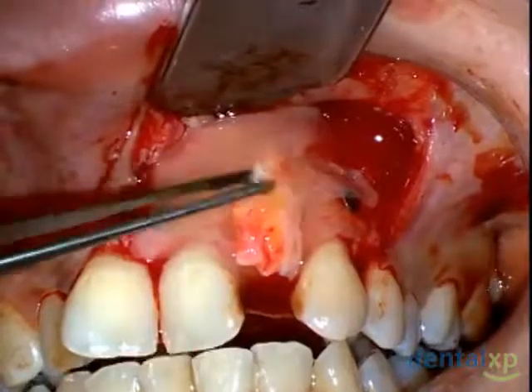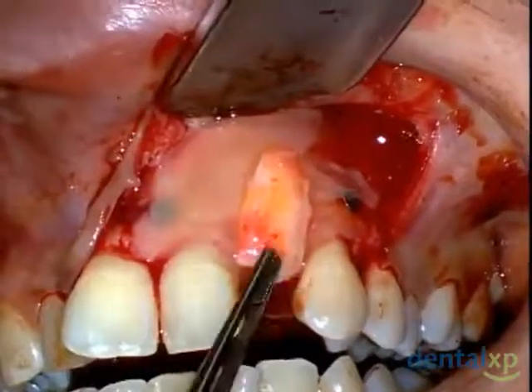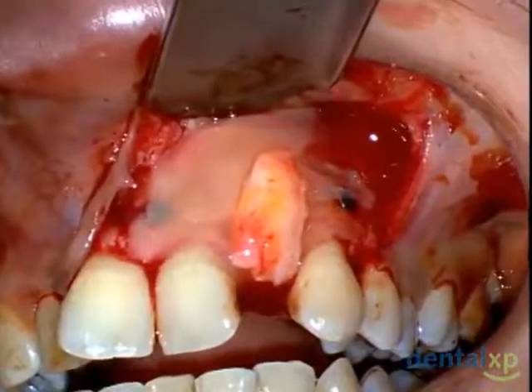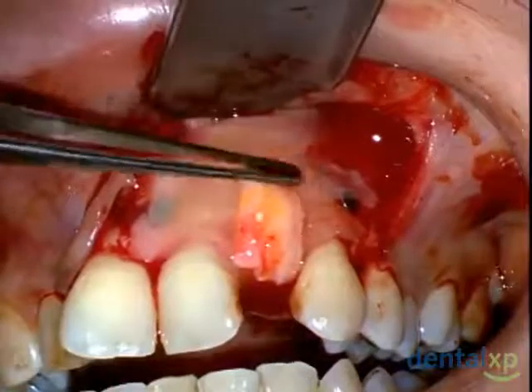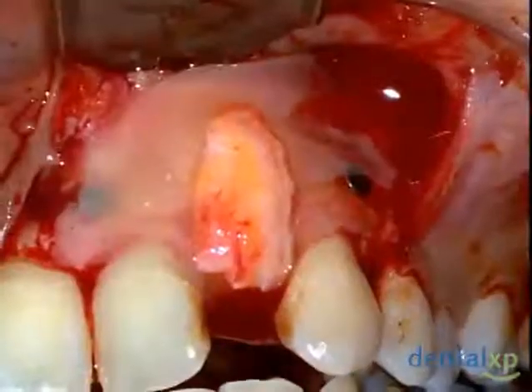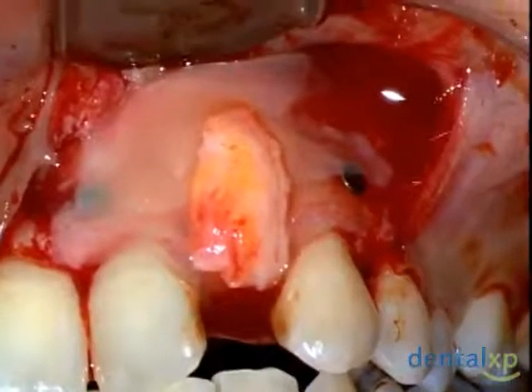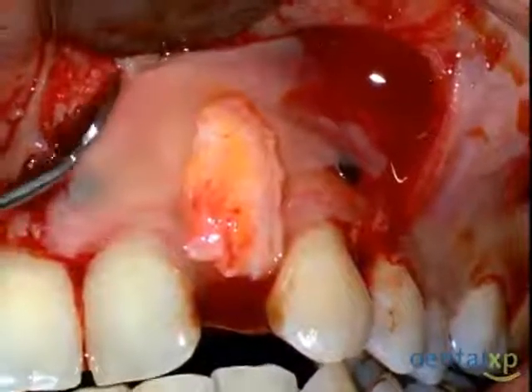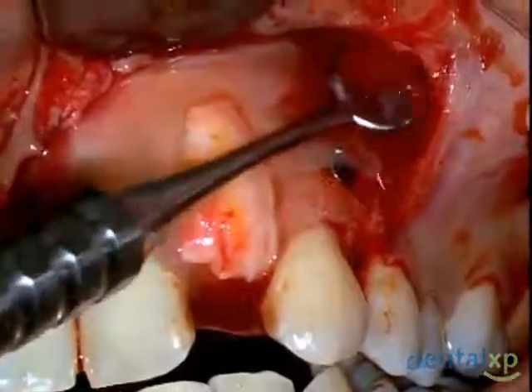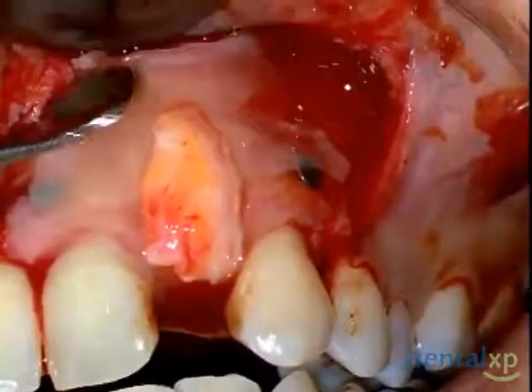So you can see the layered approach to this defect, completely cleaning out, debriding it, followed by the BioOs collagen impregnated with PRGF, plasma rich in growth factors from BTI, followed then by the utilization of fibrin and a collagen barrier, Memlock from BioHorizons with the AutoTac, and then followed after that once again with the second layer of fibrin and then the autologous connective tissue graft harvested from the maxillary left palatal region.